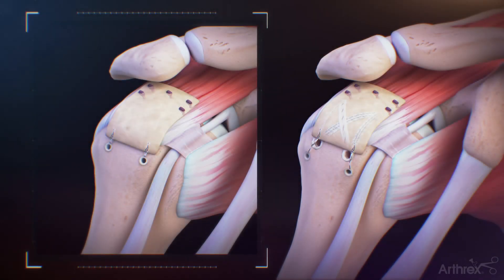The CuffMend system provides a fast and efficient technique to augment partial and full thickness rotator cuff tears using ArthroFlex Dermal Allograft.